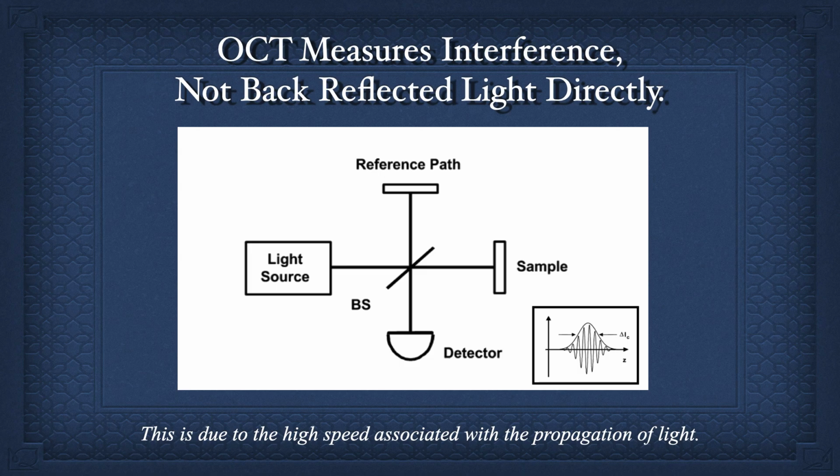So you have a light source, and with time domain and spectral radar, it's just a low coherence source. With SSOCT, the frequency is swept, so why do you need this? Why do you need a reference arm? And for some people, sorry, this is a little bit basic.